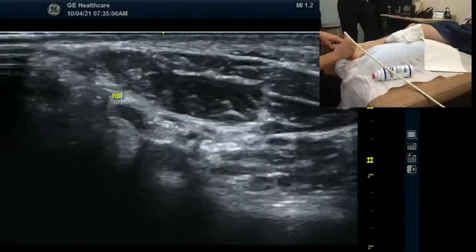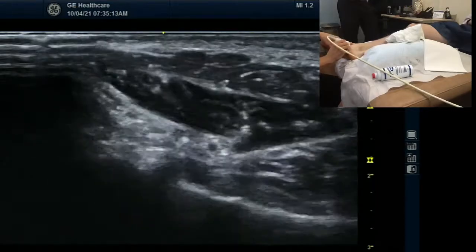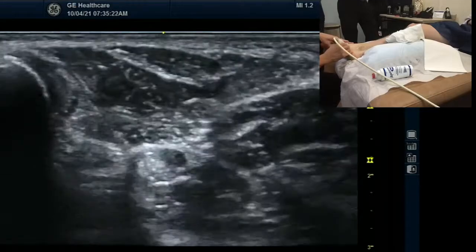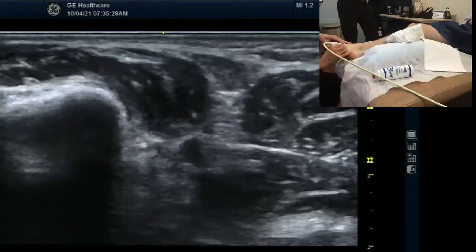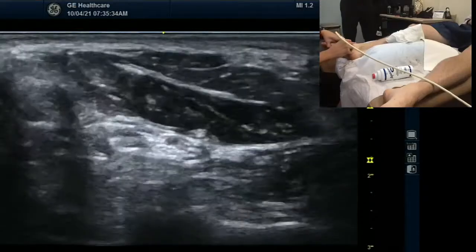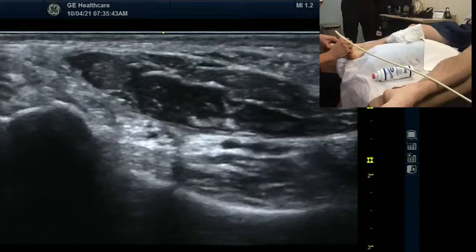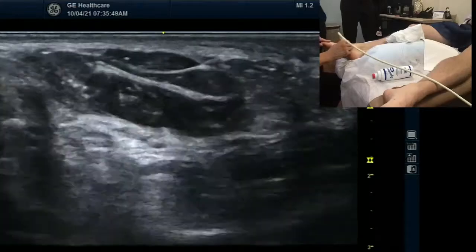Can you start from the top again? Like a little more proximally. I'm actually going to find another home base and then we'll go back up. I'm going to go through — I will be seniors. It's a very intense course. Come ready to play. So I've been very interested in learning the foot for a long time. Really? I've been trying to learn it — Jacobson covered it briefly and I've been through Jacobson twice and really didn't get much. Have you checked Bianchi? Bianchi has a really good cross section of the foot. I have the textbook.